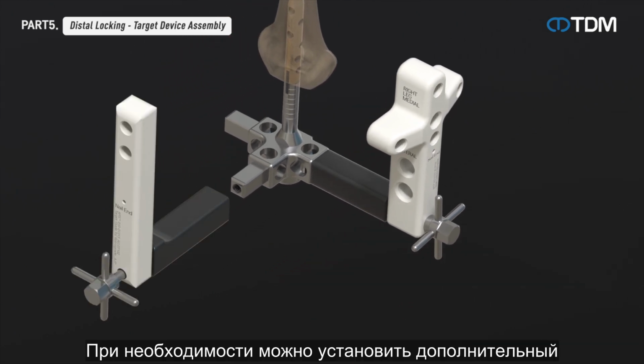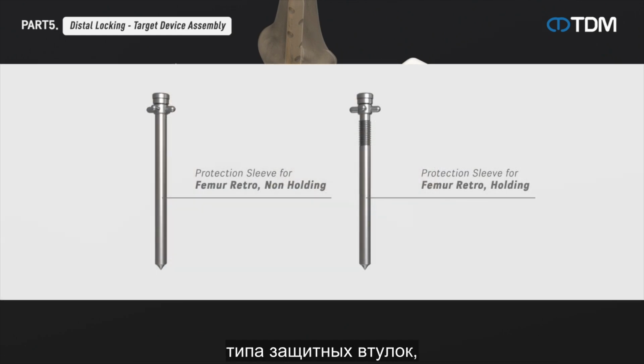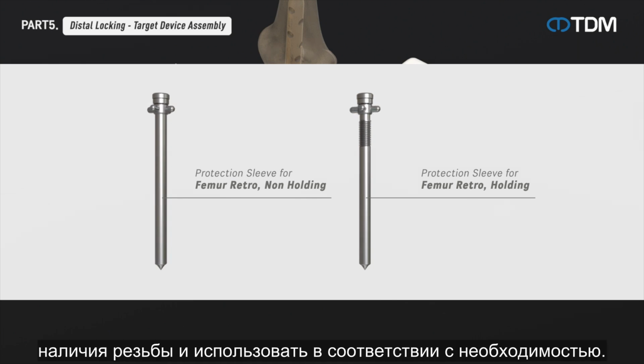Additional anterior target guide can be assembled as required. There are 2 types of protection sleeves depending on whether there is a thread or not, and select and use them according to needs.